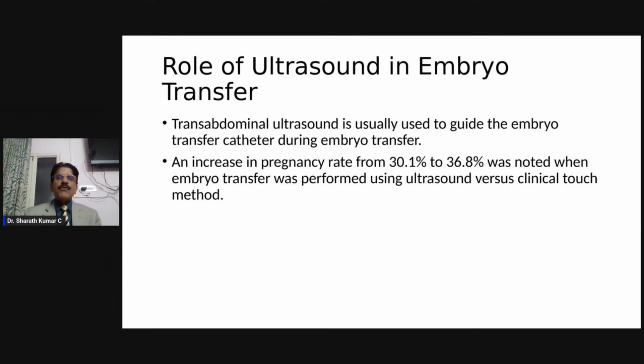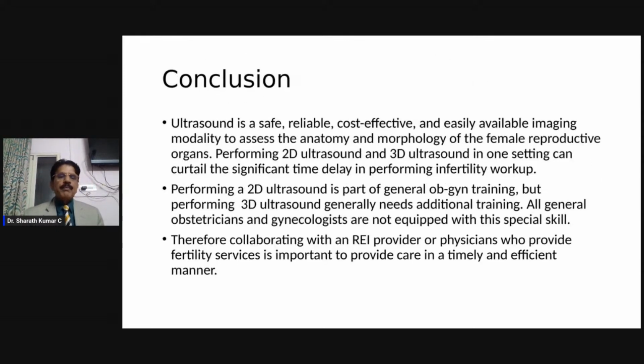Coming to the role of ultrasound in embryo transfer, transabdominal ultrasound is usually used to guide the embryo transfer catheter during the embryo transfer. An increase in pregnancy rate of 30 to 36% was noted when embryo transfer was performed under ultrasound guidance versus the clinical touch method.